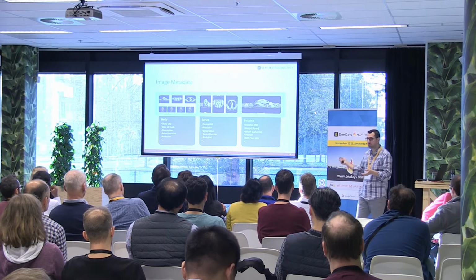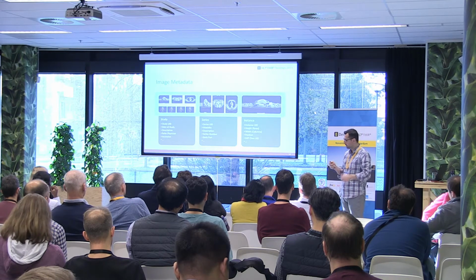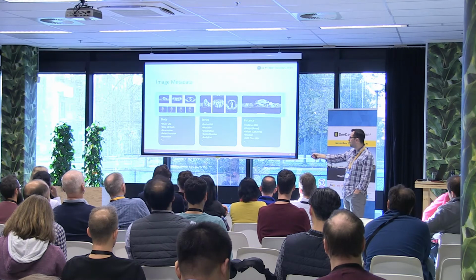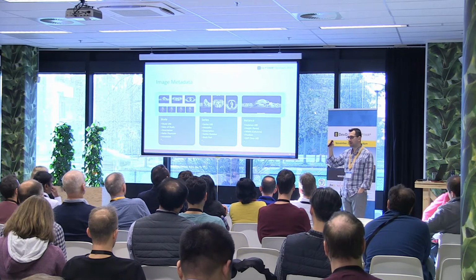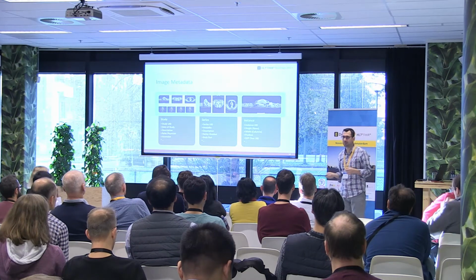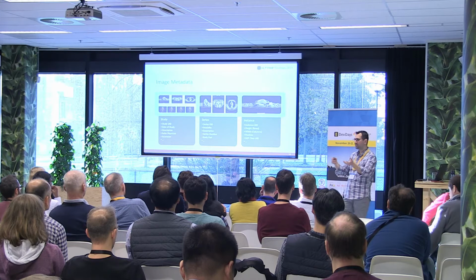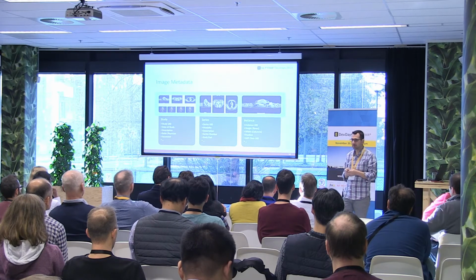So again, it just shows you the amount of information that is stored in DICOM. It's a lot more than just pixels. And then the SOP class UID is a fancy word for, basically, we saw here study UID, series UID. The class UID is kind of like the image type, fancy words for type. A lot of you who use RESTful interfaces are probably used to seeing something like MIME type. Class UID is kind of similar. It's not identical, but it's an easy approximation.